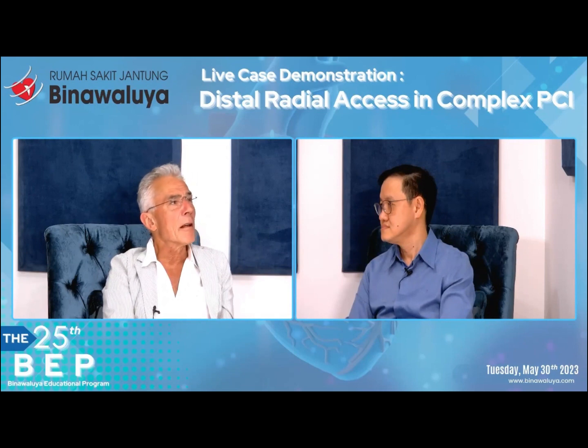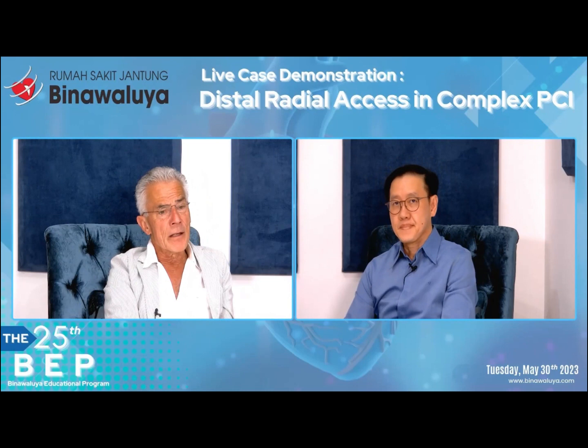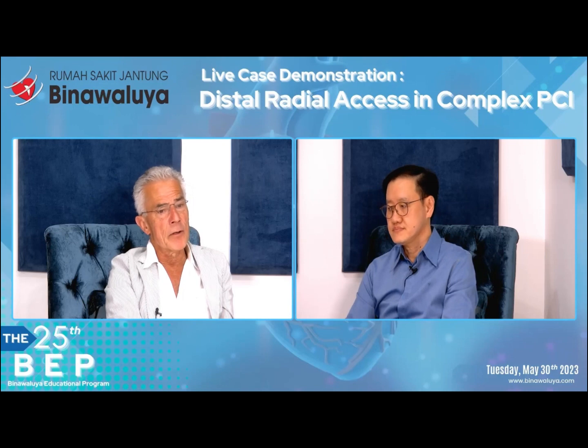But clinically it's not very relevant to reduce hemostasis time to the shortest possible time, because this bandage is convenient for the patient anyhow. So for the patient it isn't necessary to remove a bandage as fast as possible, because it will become riskier.